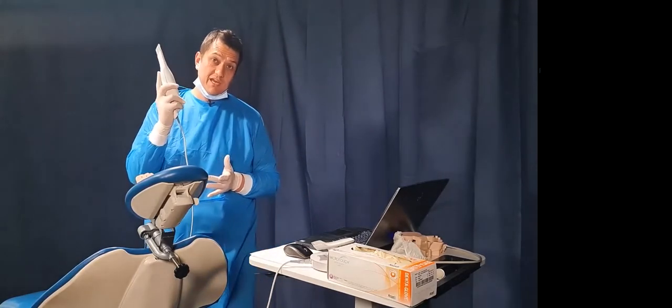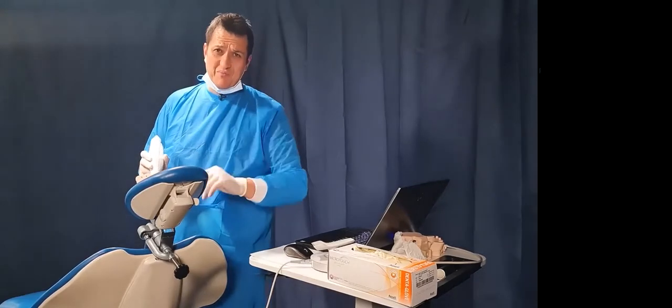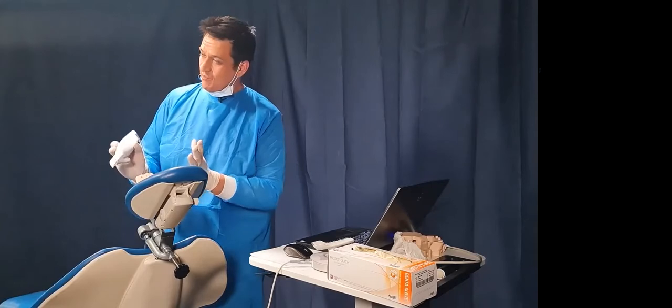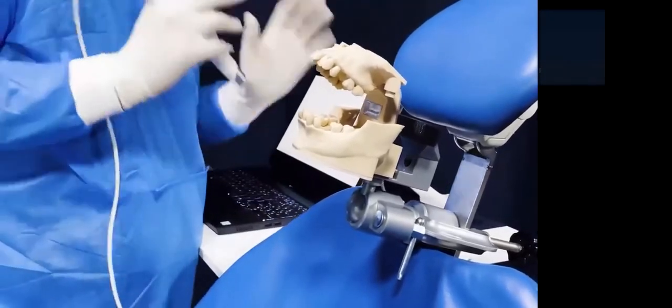So our scanner head goes, or our scanner button is on. Now the first thing I do, now a cameraman will come in and out of the screens from time to time. I hope you don't mind with our cinematography, even the professionals do it from time to time. But we want to get really good footage of hand position. And I will ask our cameraman just to come around behind me a little bit further.